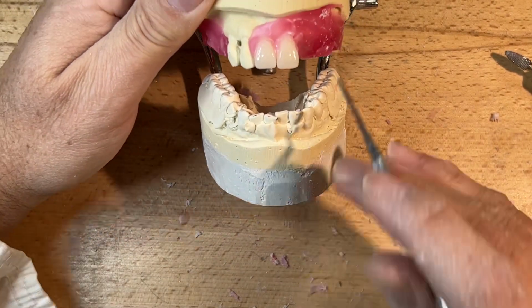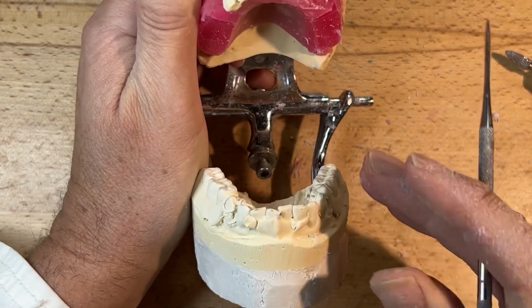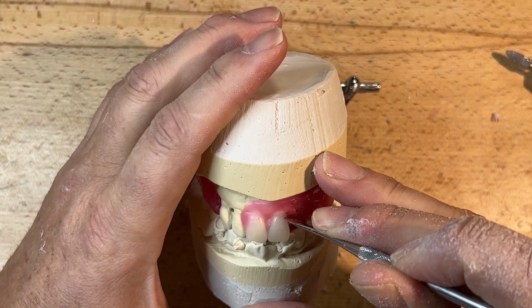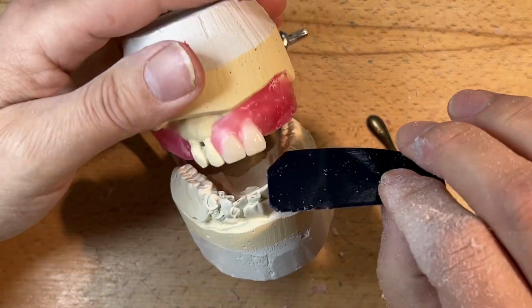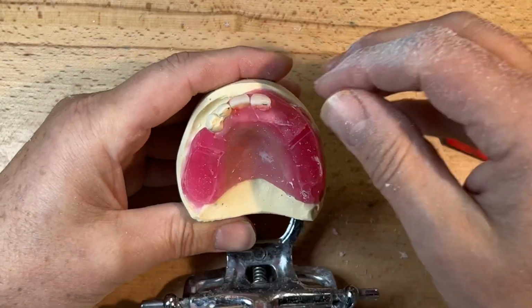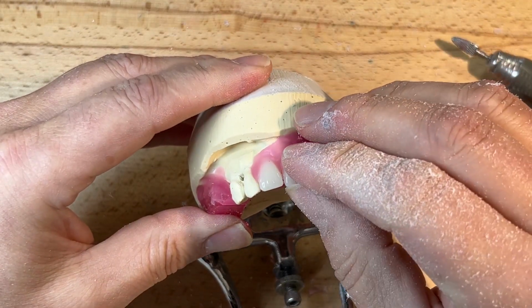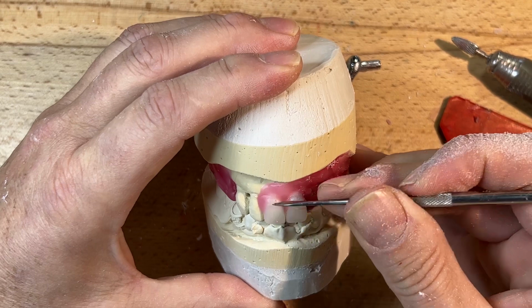Now, you can see the lower teeth here. We have some angle on this lateral and then crowding of the centrals and a crowding of the other lateral. You can incorporate some crowding if you wish on the upper. Now, this has to be in consultation with the client. And again, these denture teeth all come the same labial-lingual width. And you can see my contact there. I just want to reduce that slightly so I'll be able to tuck it in and create less overlap. You can create the illusion of overlap by angling the long axes of these prosthetic teeth.